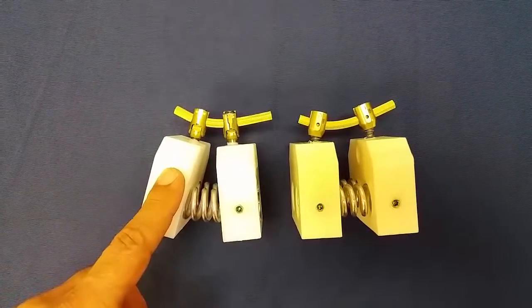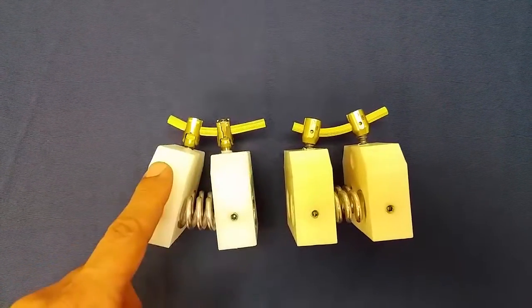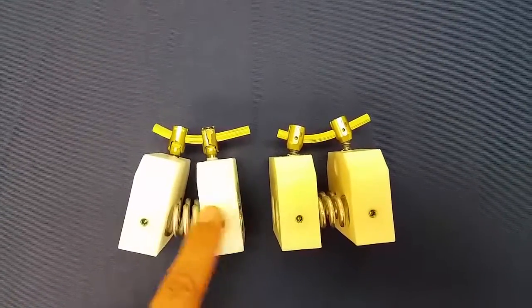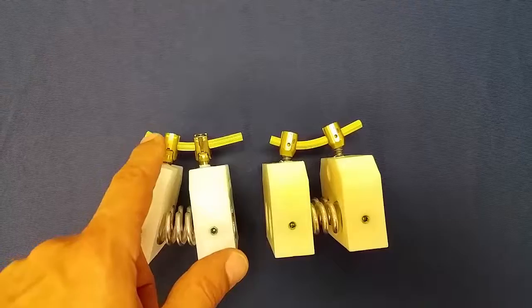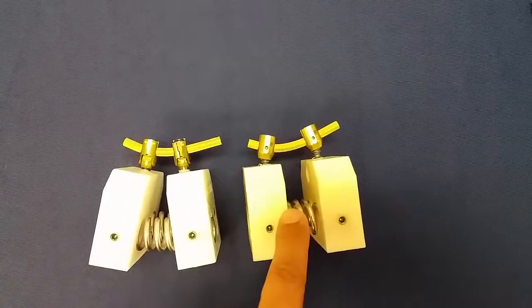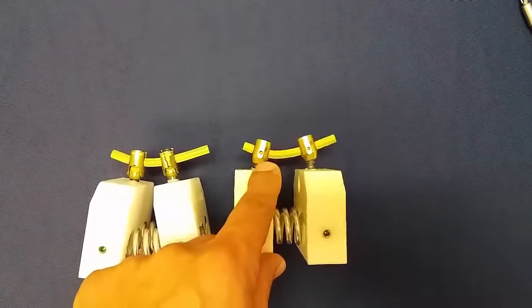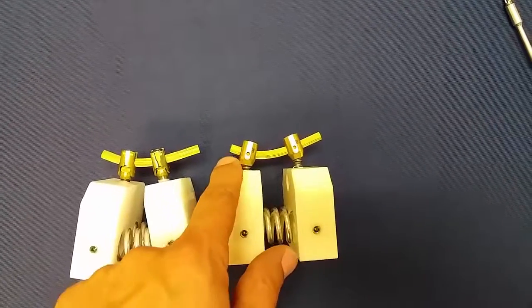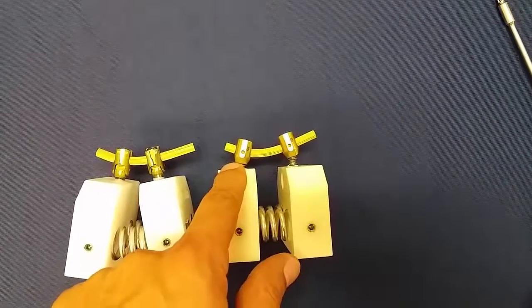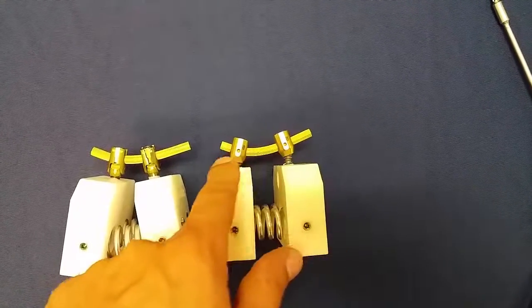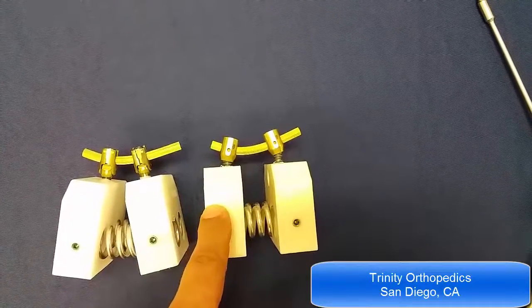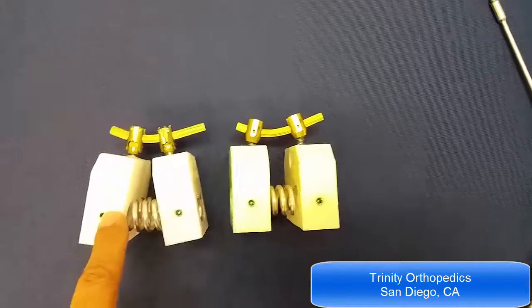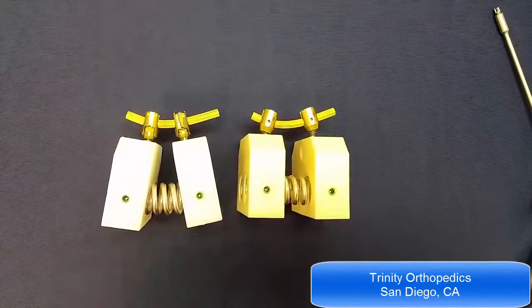You can clearly see the difference between the restore pedicle screw system which ensures that restoration of lordosis is achieved by using a curved rod versus what typically happens with a regular or conventional polyaxial screw system where a curved rod becomes accommodated by the receiver elements, a universal joint without the restoration of lordosis as signified here by the two parallel blocks as opposed to angled blocks on the left side.